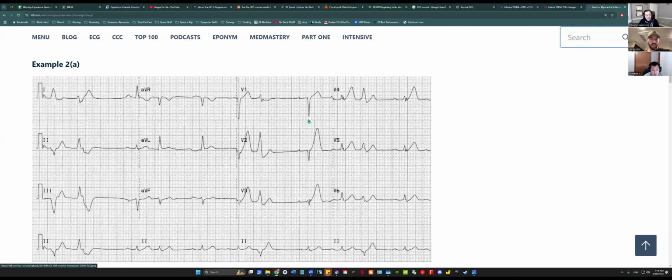See, all the little rules of thumb don't work. This is where, if you have an EKG without the rhythm strip, it's almost impossible. This is why EKGs contain rhythm strips. Lead 2 and V5 are the common ones. If something looks weird like this, your first port of call is to look down here. Which beats can I use? Then throw out the PVCs because they're not going to be helpful. I didn't realize that bottom part was the tracing. Yes, that's why they include the tracing, so that you can see one lead across all this time, and then throw out the garbage.